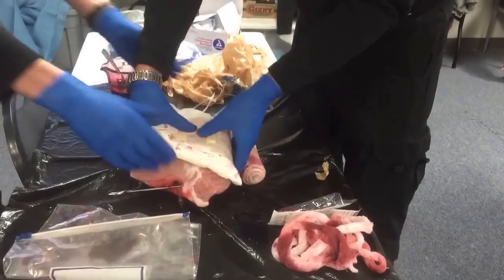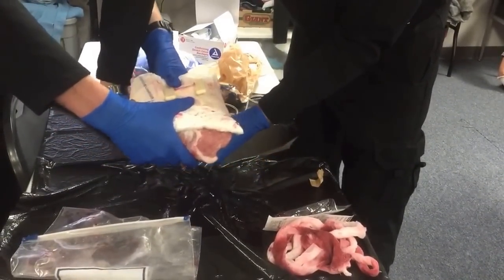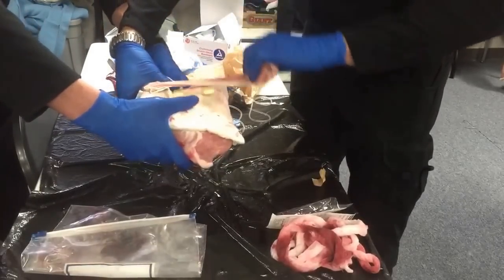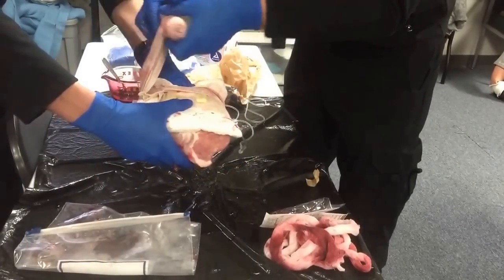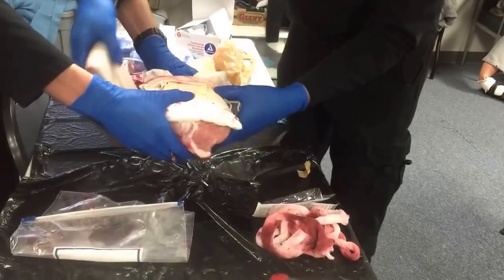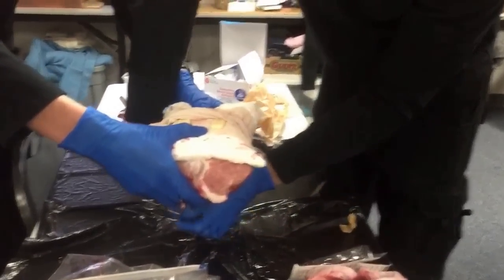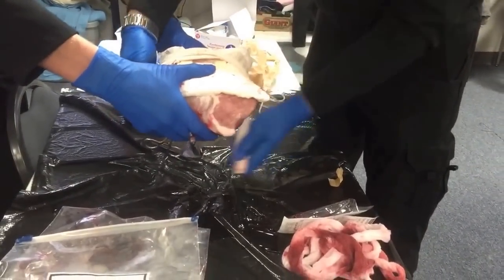Our partner's going to come here and help us elevate the extremity, and make sure we're twisting as we go across the top of the injury, keep the pressure right on the wound. This is a compression bandage — this is not a tourniquet, just a compression bandage — keep the bleeding controlled.